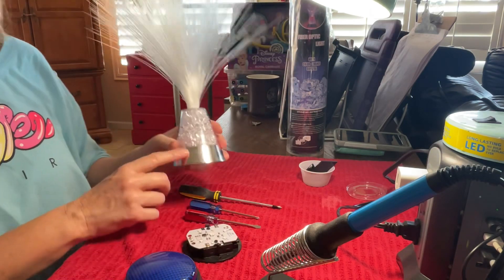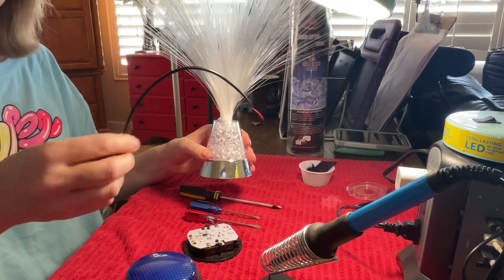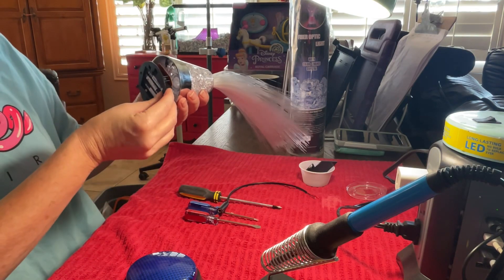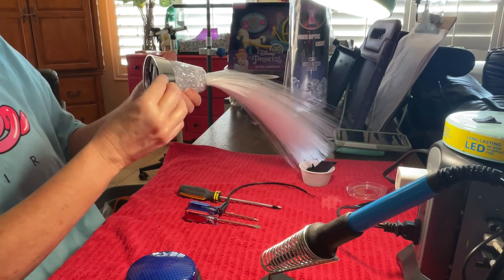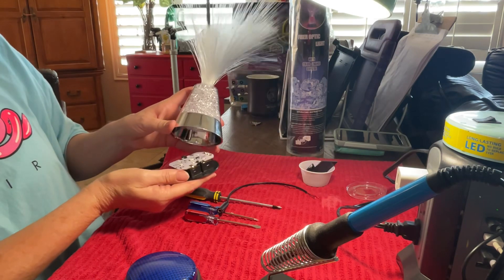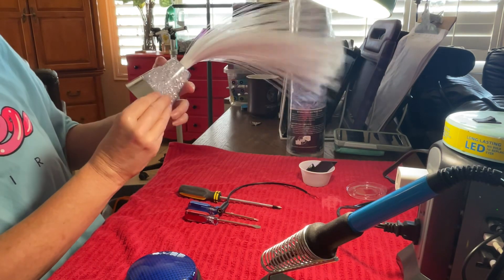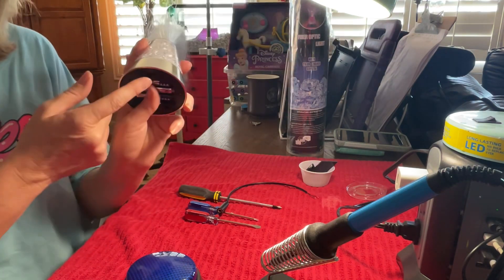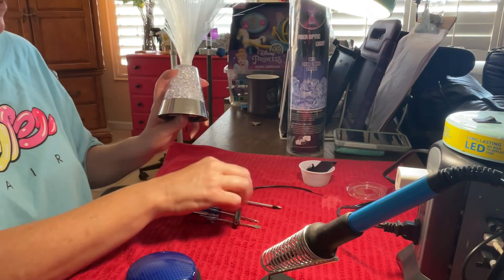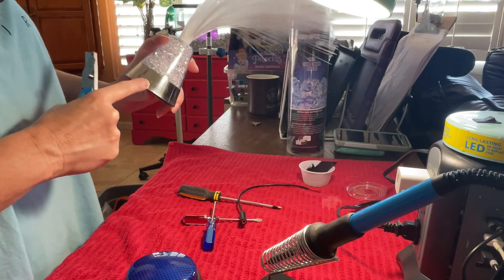Now I'm going to find an appropriate place to put a hole so we can fit the jack right through it. Let's put this back on so we have things in the right places. It looks like the switch is right here on the bottom, so about right here I'm going to put the hole to add the 3.5mm female stereo jack. I'll mark it with a knife so I know where to put it — approximately right there.